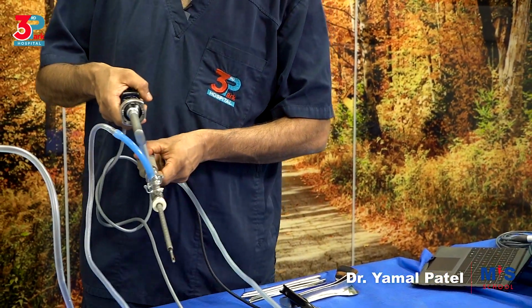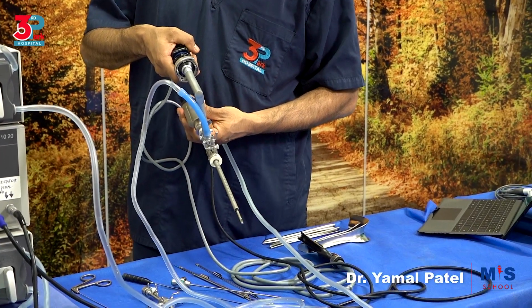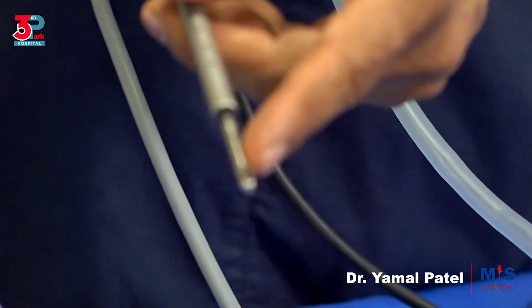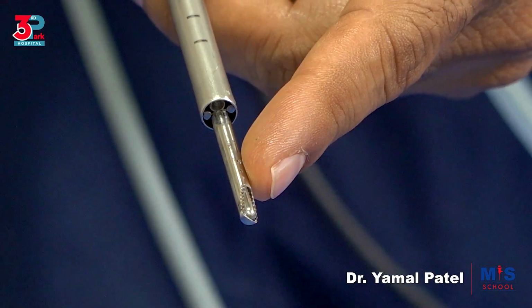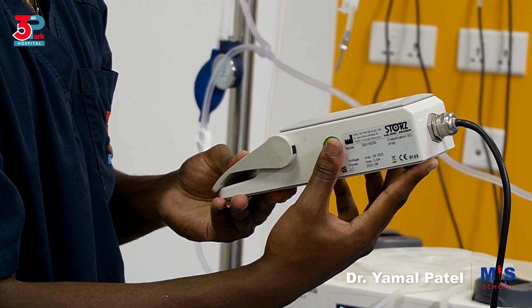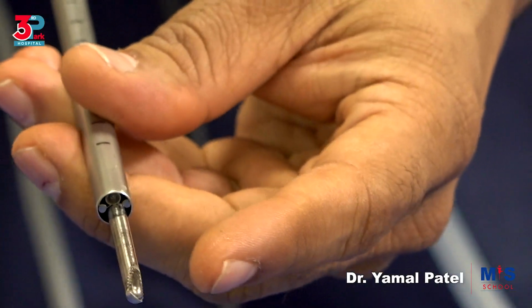If you press this, can you show me? So you can see it's moving. So look here, that's the shaver blade that is moving now. So this is going to shave off the pathology, polyps, fibroids that are submucous type 0 or type 1.